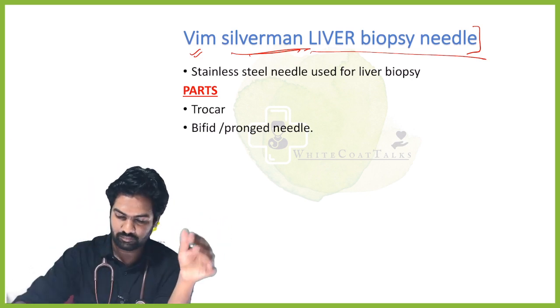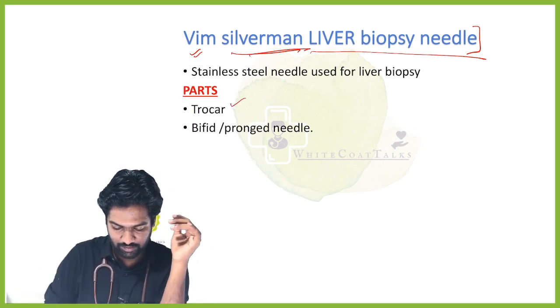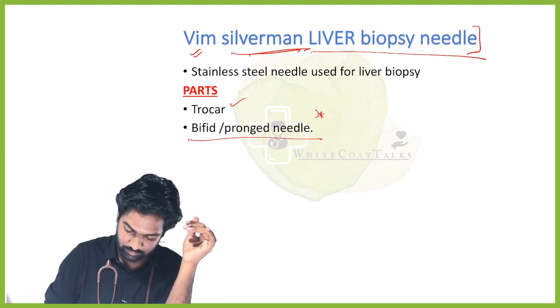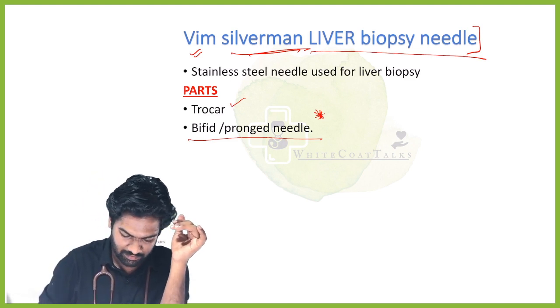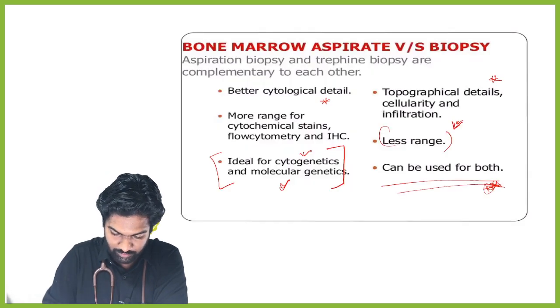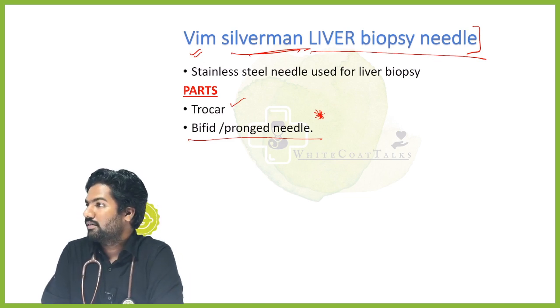Again, the parts here are the trocar and a bifid or pronged needle. I'll show that, and I'll even let you know why it is bifid. Any doubt in biopsy? The bone marrow biopsy needle is not there, guys. Can't help it.